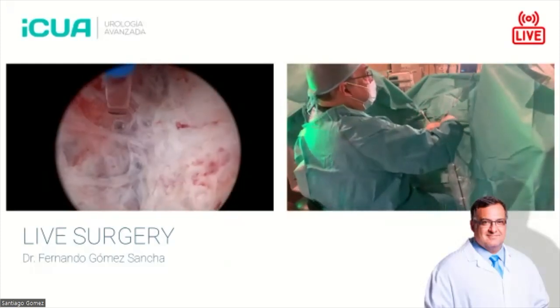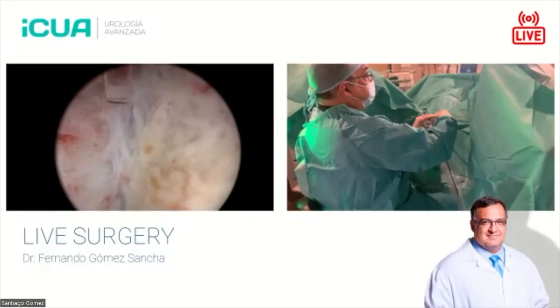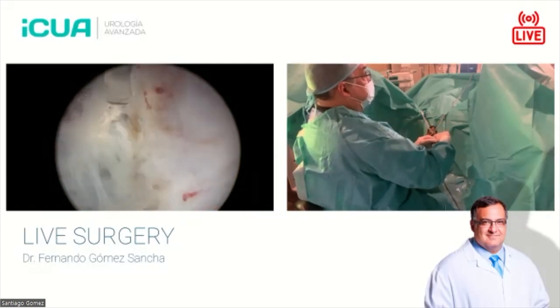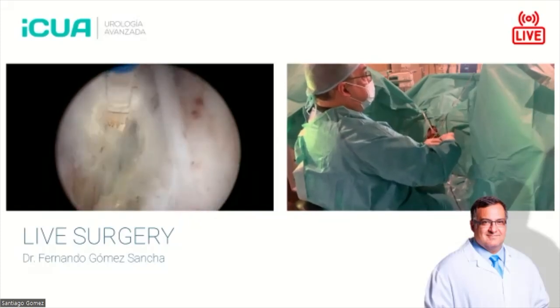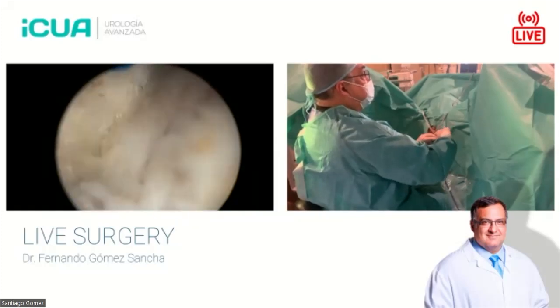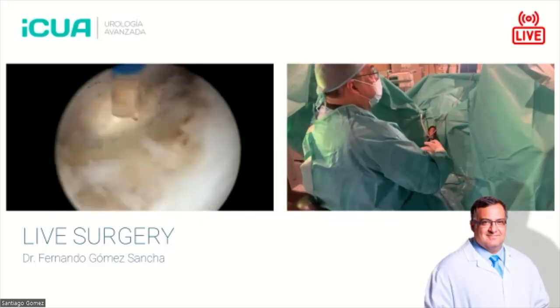When you have a line of dissection, you have to judge the characteristics of the plane. If it looks a little bit deep, we will fire closer to the adenoma. If it looks like we are leaving yellow tissue, we will fire a little bit outside so that we can take the tissue with us, with the bulk of the prostate that we are dissecting.